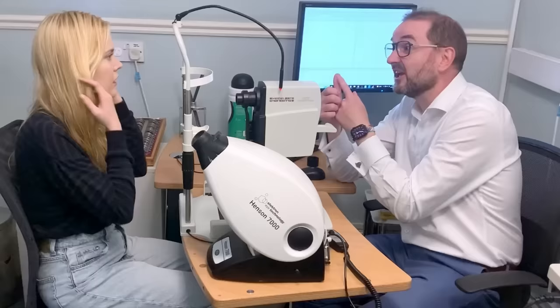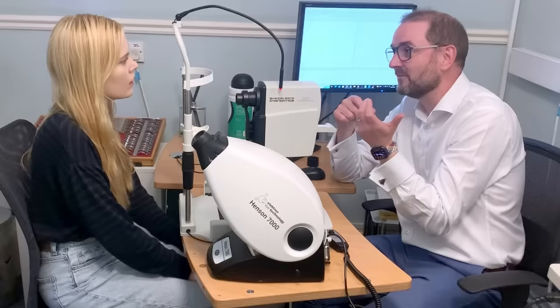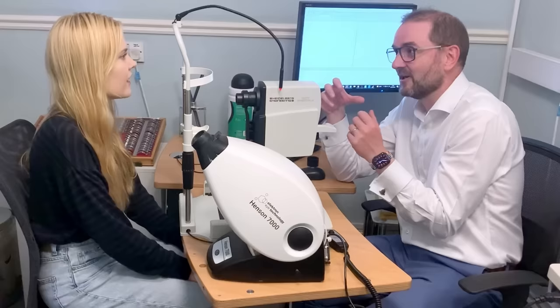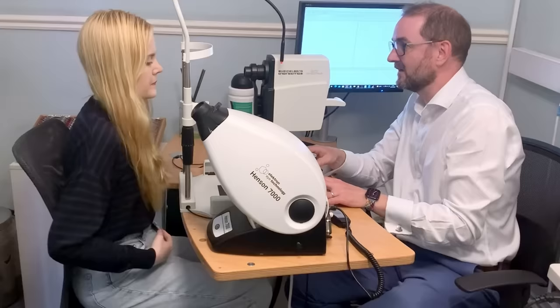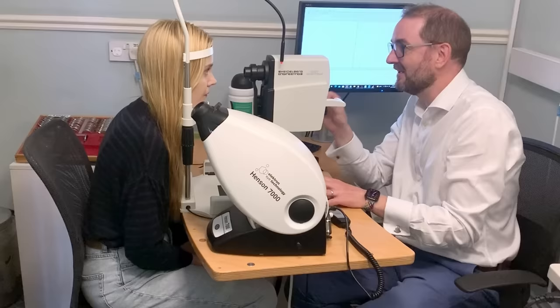One of them's more for glaucoma, that's the optic nerve, and the other one is more for things like macular degeneration, which is normally age-related, so as you get older. It's just good to have these things, and it gives us a 3D picture with a lot of detail. It's not a photo, it's like a scan of the eye, so that's why it's really good. If we do the scan first, pop your chin in there and your forehead on the top if you can, because if I keep your head still, we get a sharper image. So let's just do this.